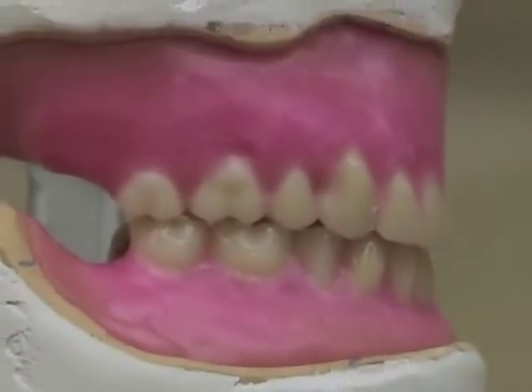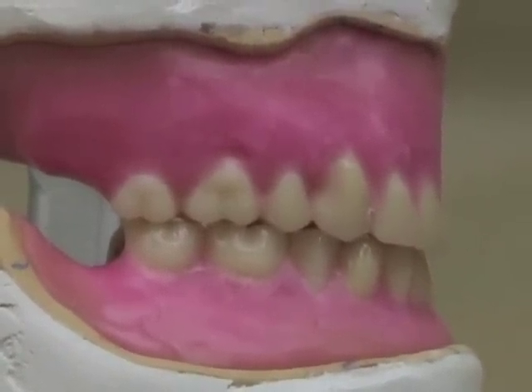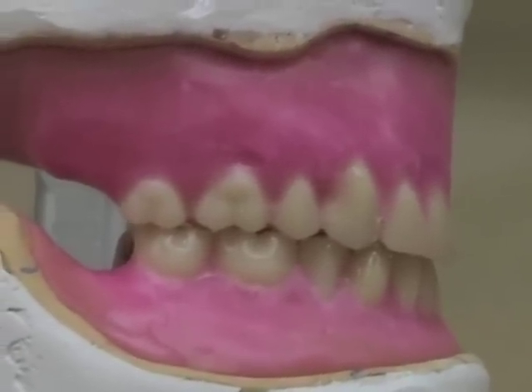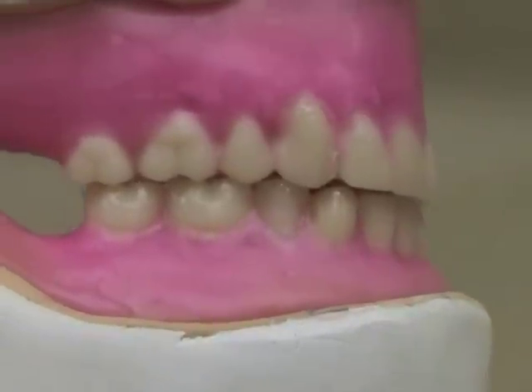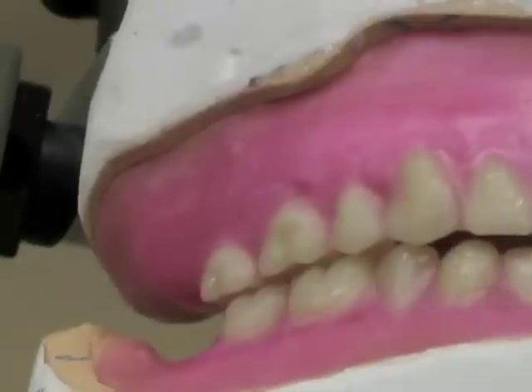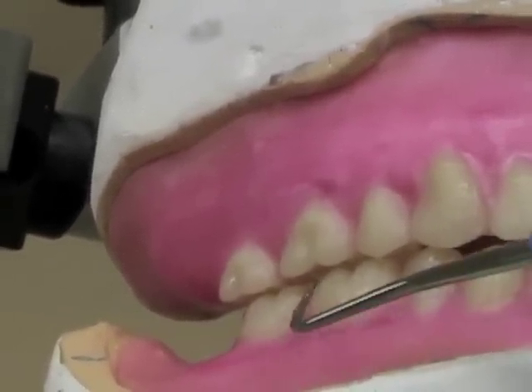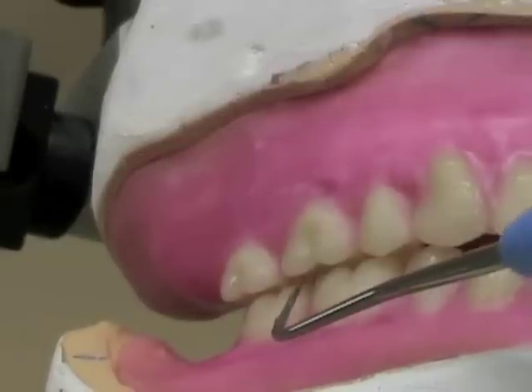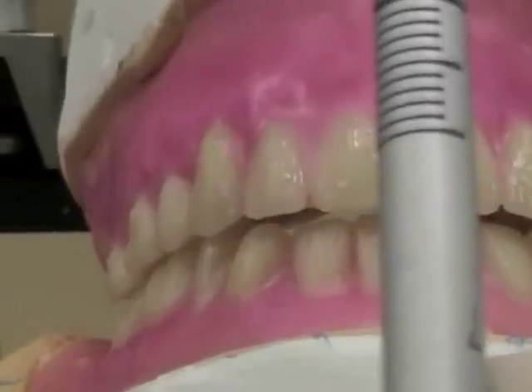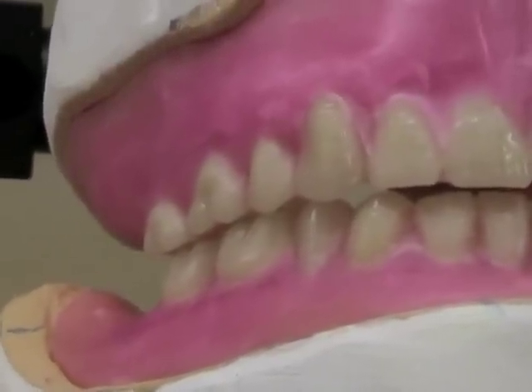Once you have all of your denture teeth set in wax, you'll find that you may have to slightly move them or refine the centric stops after the wax has shrunk during the setting of the teeth. The first thing you should check for is that you have some space between the buccal cusps of your posterior teeth. You should have about a millimeter of space between the buccal cusps and at least a millimeter of overjet. The buccal cusp should not be touching in centric position.